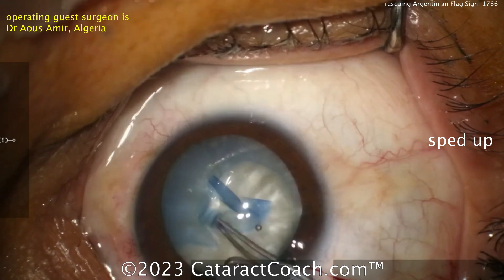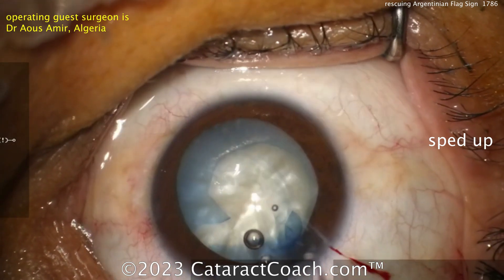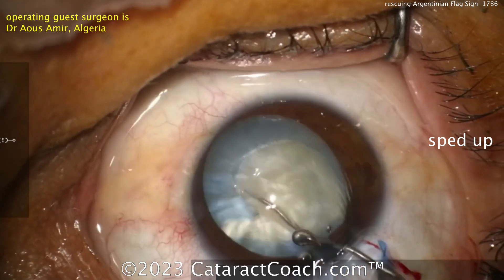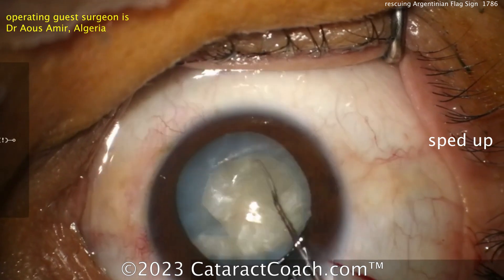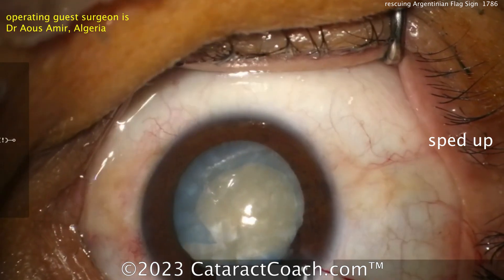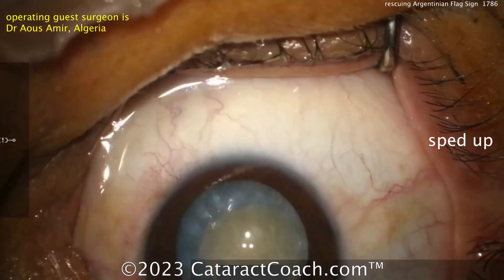Micro scissors — a little cut there. Continue this. Now you've got that one area of weakness. Do you enlarge even more on the rhexis? I like this idea: decompress a little bit, rock that nucleus, get it rotated a bit. But the question is what do you do with that big flap there.